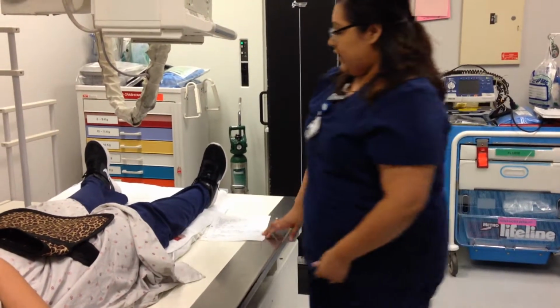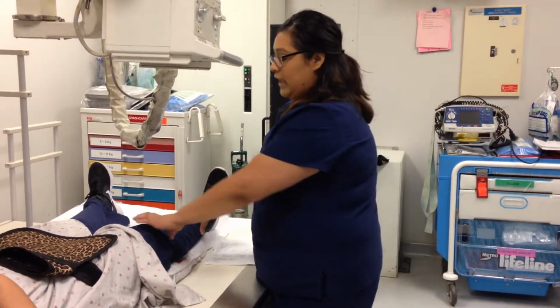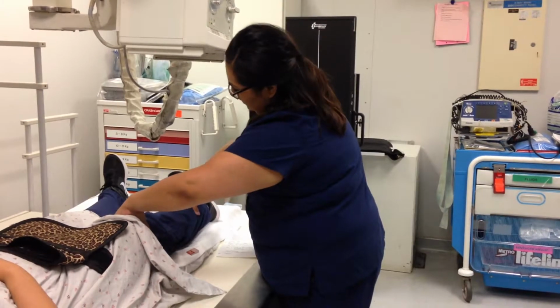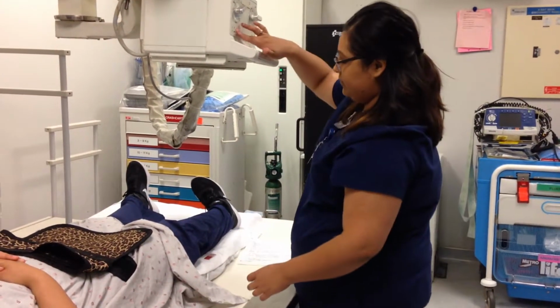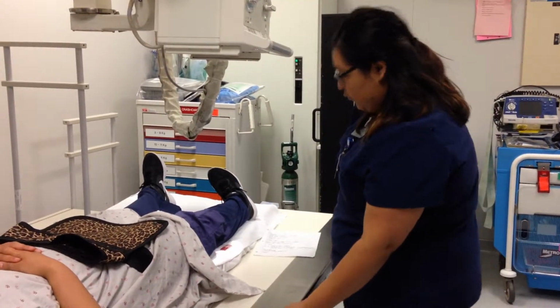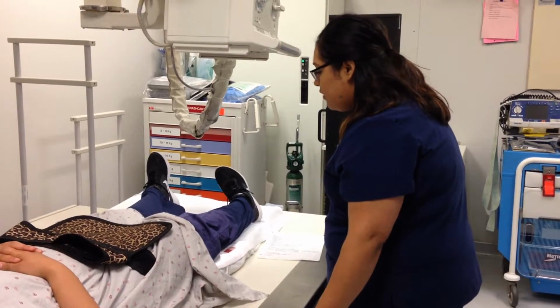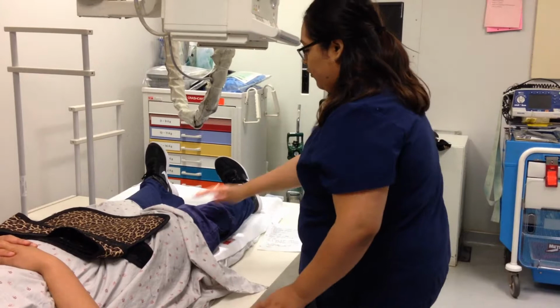And then for the next projection, the AP oblique with medial rotation, we'll be rolling the leg inward 45 degrees. We'll be moving your leg, Ms. Garcia, okay? And we want to make sure it's the whole leg, not just the foot. We're keeping our marker here, and keeping the same tube angle for this projection. And we'll be using the same central ray as well, half an inch below the apex of the patella. And of course, collimating appropriately.